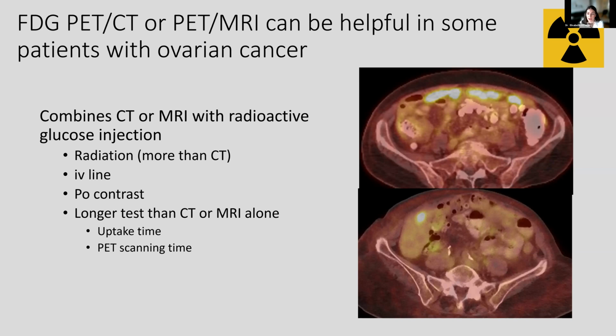This can be really helpful to delineate small focuses of tumor, and it can also give us a good idea, especially in the setting of targeted therapies, if they haven't decreased in size, sometimes we can see that they've become metabolically inactive, which is a good marker that they're not active, or that the therapy is working. This is typically done with a CT, but in certain centers it can be done with an MRI, which honestly isn't always necessarily better.